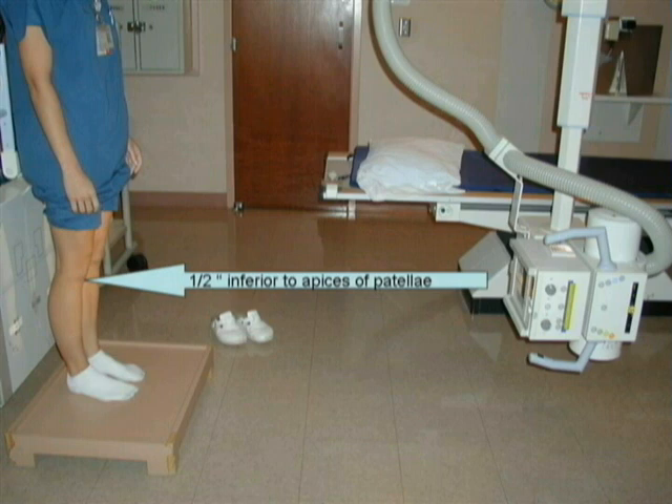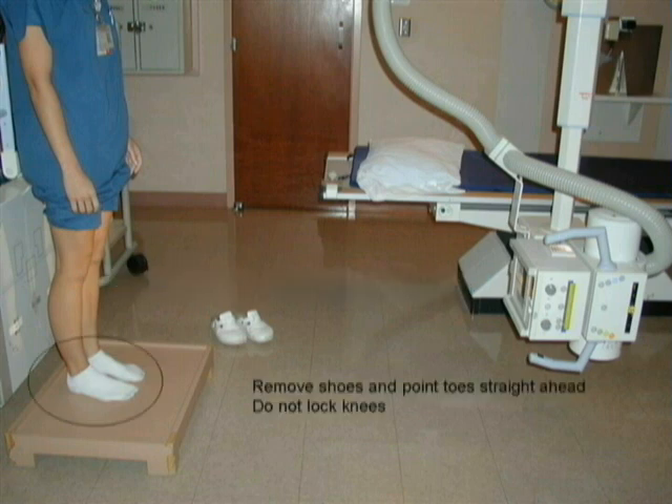Collimation improves radiographic contrast. When making the exposure, the patient should remain very still, but suspended respiration is unnecessary.